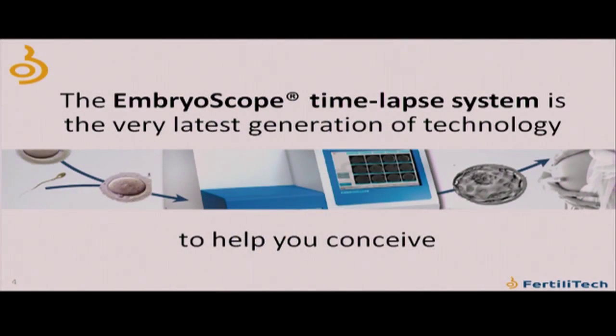And that's what you see in the bottom. You actually see the embryo viewer. It's a workstation that has the time-lapse videos and also some software for analysis that the embryologist can do on the videos. And here's our EmbryoScope time-lapse system. It's the latest generation of technology to help you conceive. And with that, I'd like to introduce our speakers today.